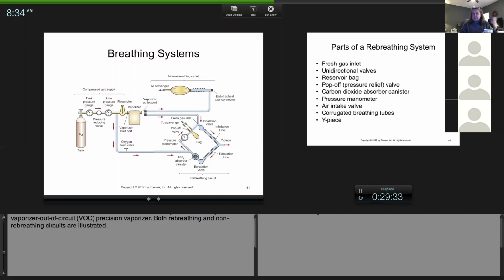And again, like I said, some clinics use what's called an F-air canister. In the prep room, the dental station, it's a charcoal filter, and when they exhale, it goes into that filter, and that filter absorbs the anesthetic. What I don't like to see, and I'm sure at least one of you may experience it, is that sometimes people just lay that hose on the floor.